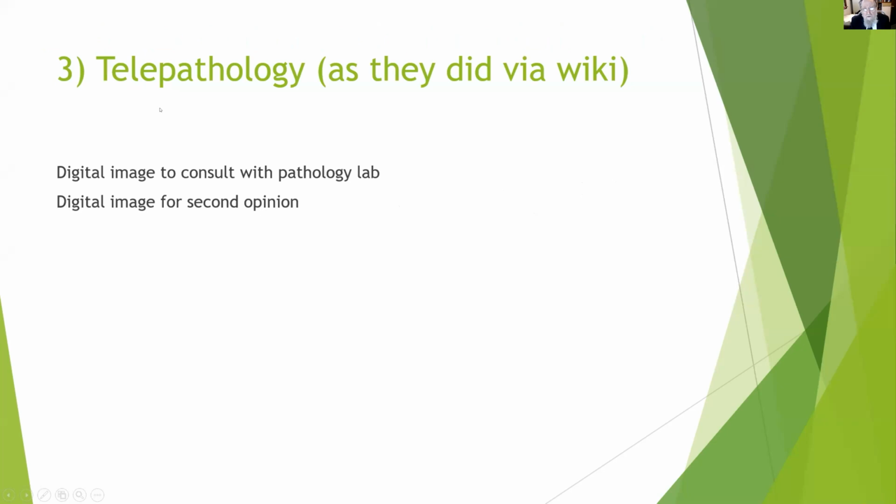And thirdly, as I anticipated, and as they did with this wiki, you have training in the world of telepathology. Telepathology means the physician at his desk can consult with the pathology lab. They can both look at the same slide. They can discuss it if need be.